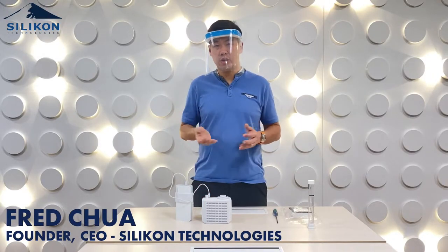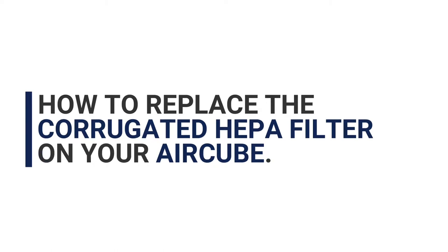Hello everyone. In this video I'd like to show you how to replace the corrugated HEPA filter on your air cube.